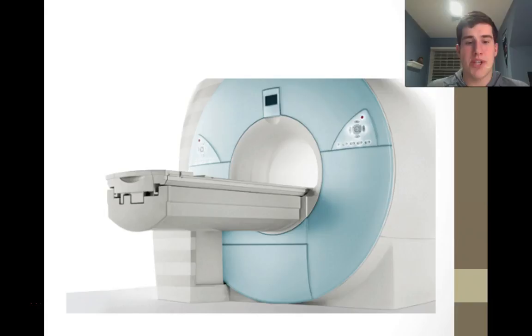Magnetic resonance imaging, better known as MRI, is a technique for creating detailed images of the human body. A lot of doctors like to use this method because it's non-invasive and painless, and there's no ionizing radiation, which could cause harm in the future, like X-rays or CT scans if used a lot.